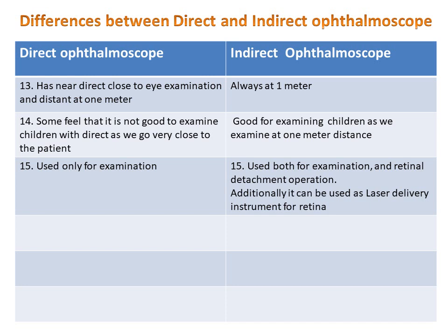So apart from indirect ophthalmoscopy, you have a slit lamp delivery system of the laser, and you have what is known as the endoprobe delivery system. Endoprobe delivery system, you have some probes which are extremely small, 18 gauge or 23 gauge, which can penetrate through the pars plana region, and you can directly photocoagulate the area which you want when you are doing vitreoretinal surgery. So you must know that indirect ophthalmoscope is used both for examination and for major surgeries on the retina.